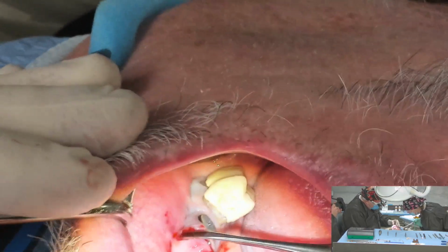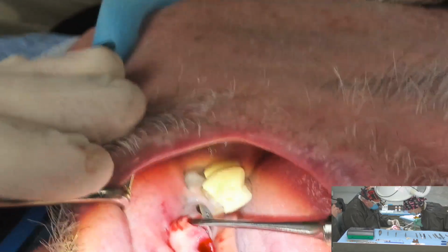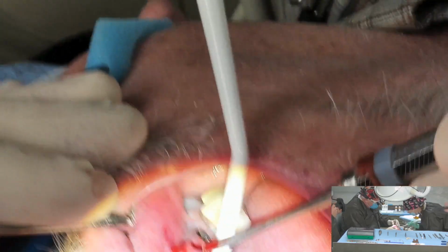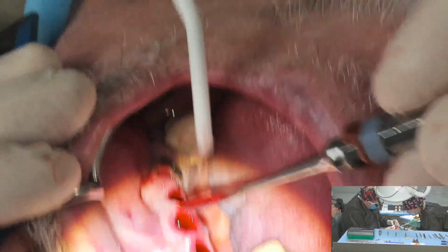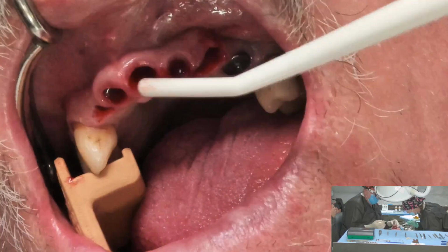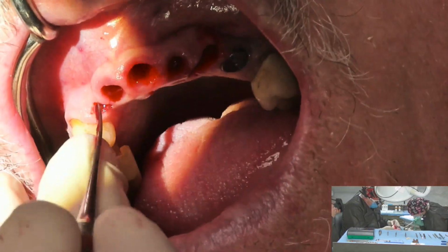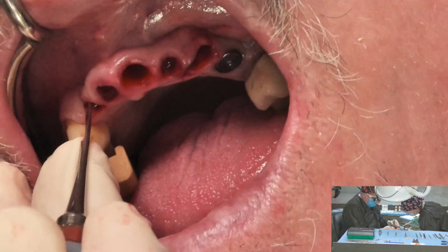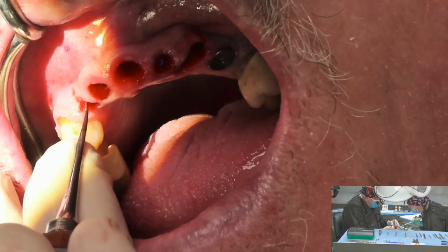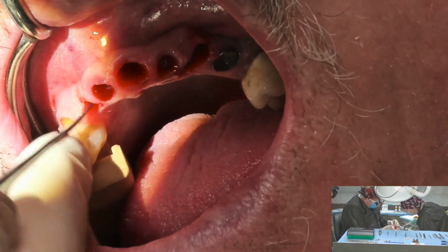Now, we know that most of us in the adult population, of course, we're not children in the adult population. Well, I shouldn't say that. Some of us are children in the adult population. I happen to be one of them. Have either fenestrations or dehiscences over the buccal root surfaces of the maxillary anterior teeth. So we're always doing some sort of regeneration facially, in my opinion, to an implant, especially in the aesthetic zone.